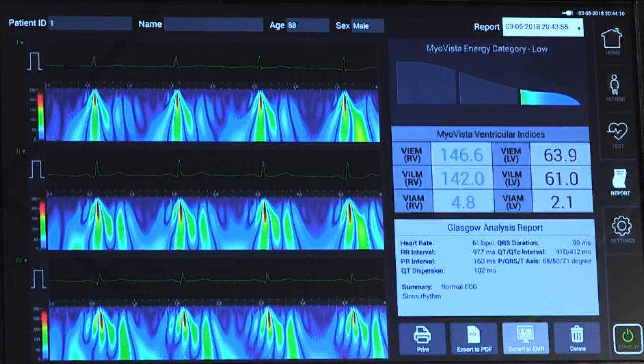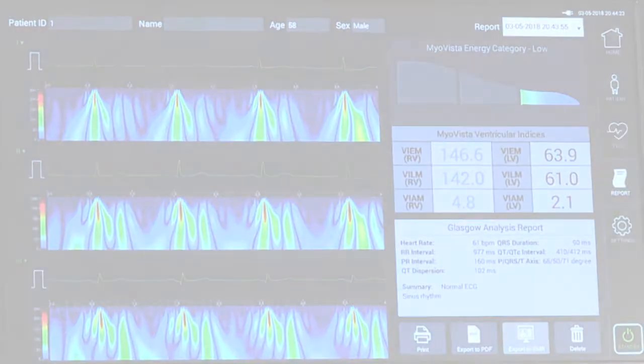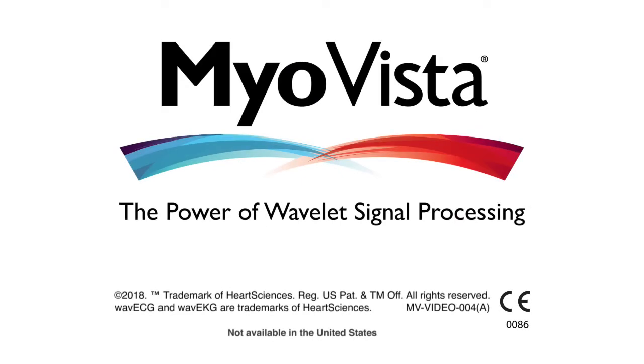Upon test completion, the report screen will automatically appear. All reports can be viewed directly on the MyoVista Wave ECG device screen, exported to a PDF, or printed to a local printer. For further questions or instruction, be sure to reference your user manual or contact your Heart Sciences representative.